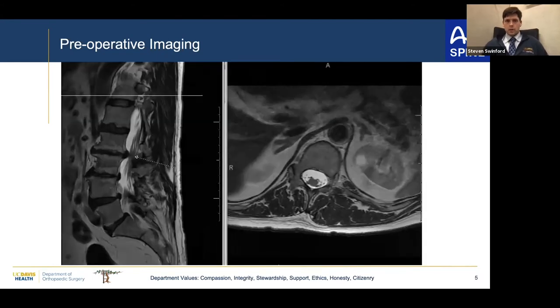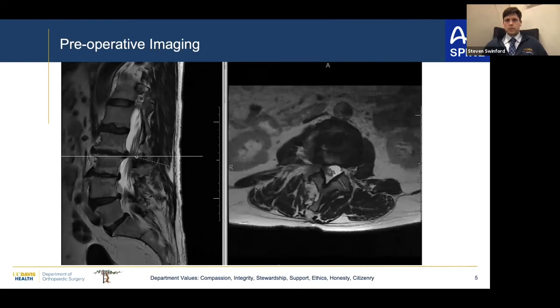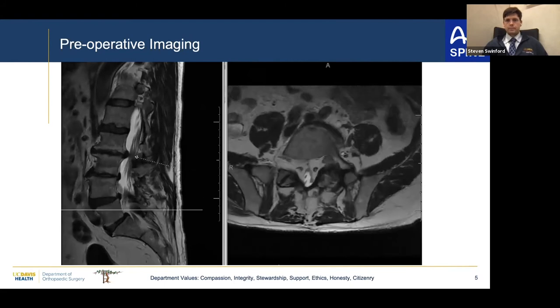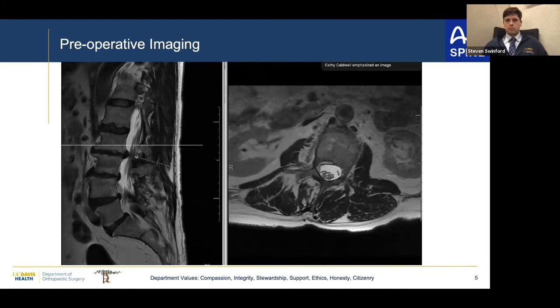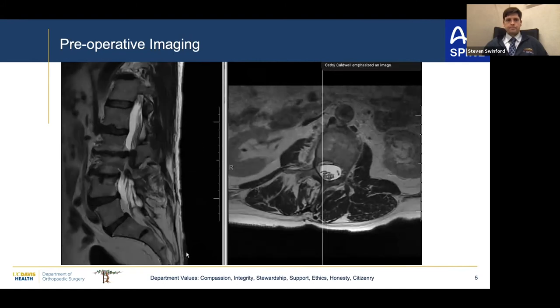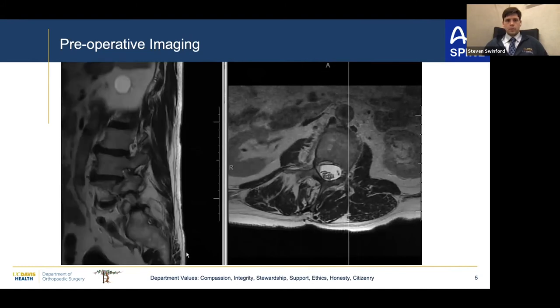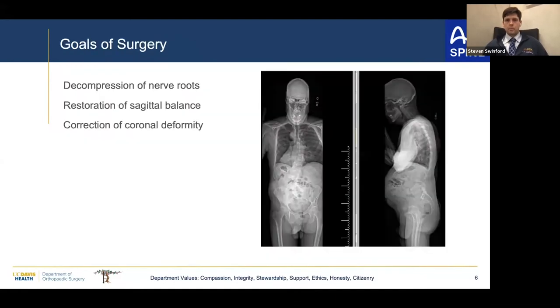I have this MRI just to show kind of how abnormal his lumbar spine is, clearly compression in multiple levels throughout. He's had prior surgery, and I think clearly has reason to have this sciatica. Interesting point that I wasn't really aware of before fellowship. Frequently it's at that fractional curve down at the lower aspect where they experience it. So his left side where he's got that left convexity.